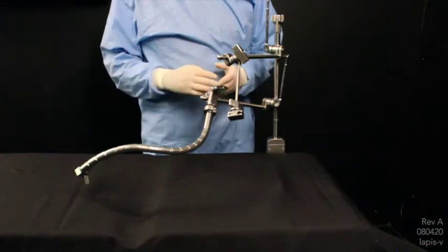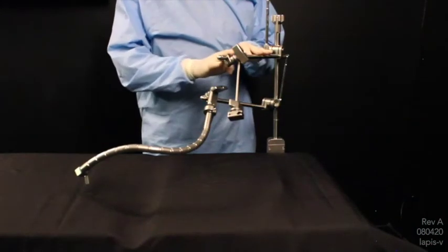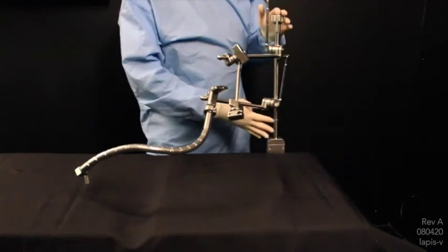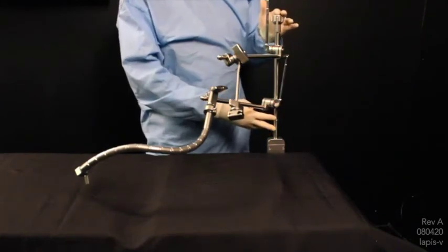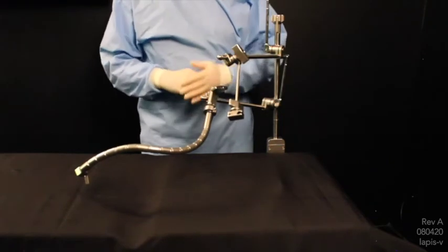If two laparoscopic arms are needed, being the flex and rigid, you will need the Elite Rail Clamp with two joints in order to accommodate both arms.